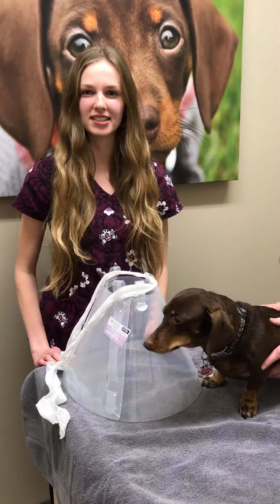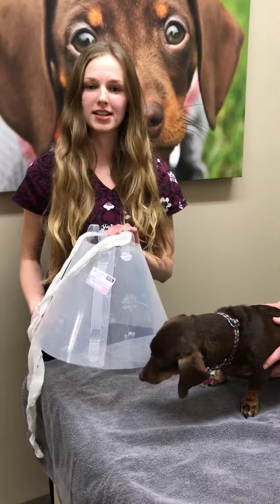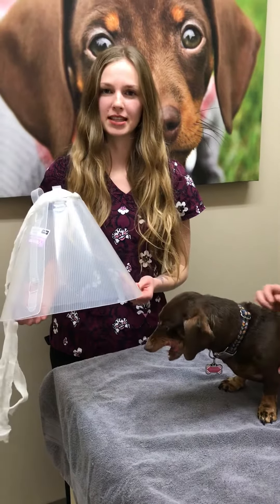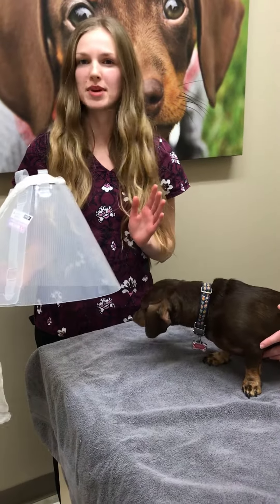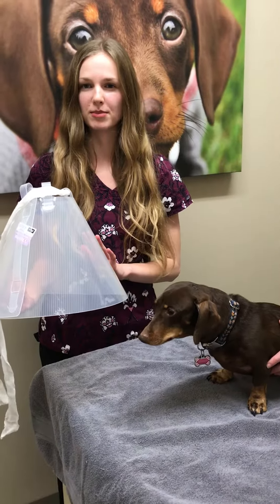Hi, I'm Lauren. I'm one of the technicians here. I'm going to show you how to put an e-collar back on, had you ever had to take one off. We normally send these home with our surgical patients, as well as for other cases where your pet may have a wound of some sort — anything where the veterinarian would recommend that we keep this on.